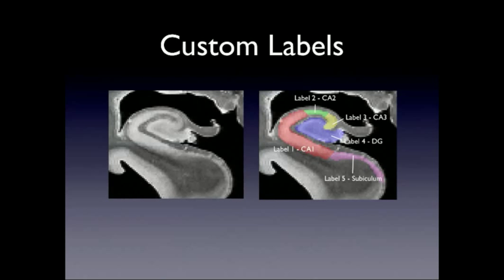So the first thing to talk about, this is another T2 image of a coronal slice of the hippocampus and the subfields. The first thing we're going to talk about is custom labels. So where Paul touched on this briefly, about how you can read the end labels, the idea is that each label has its own integer value, and all that is is an identifier. So you would use these for statistics, for instance. If you want to know the volume in the dentate gyrus, you'd count the number of voxels that are included under label 4, dentate gyrus.